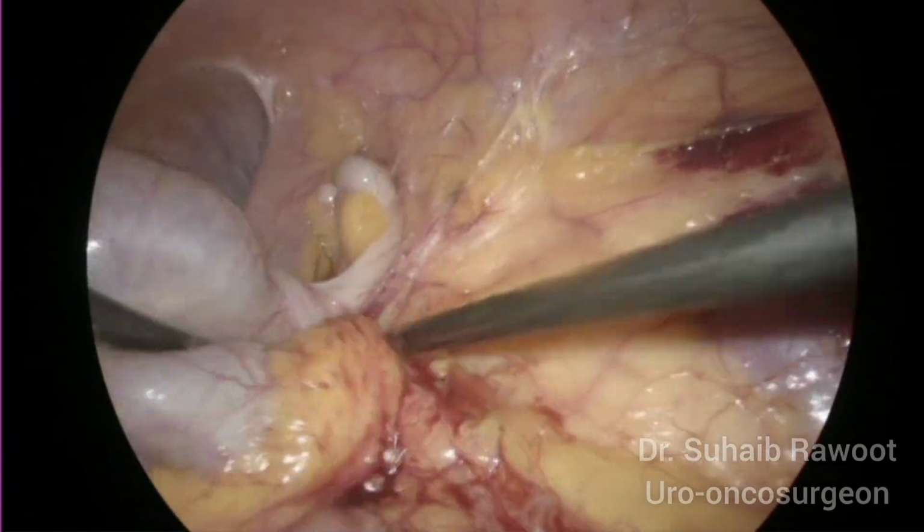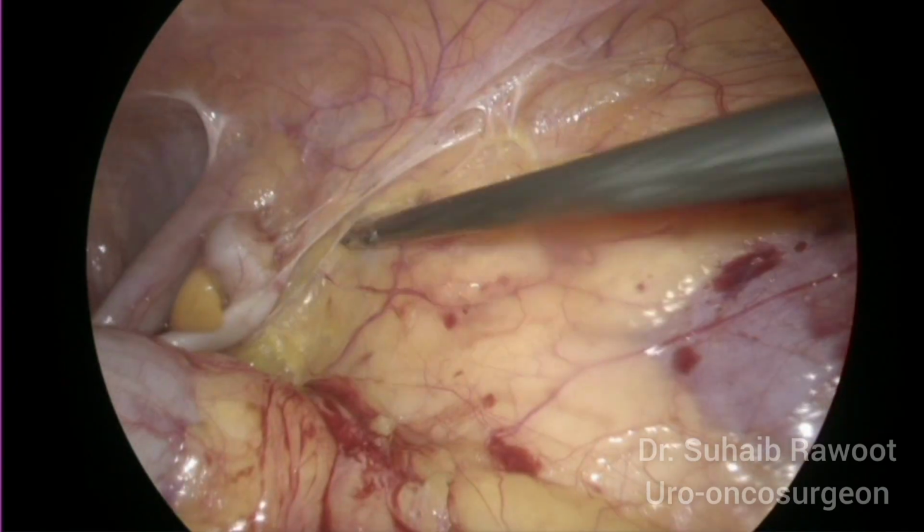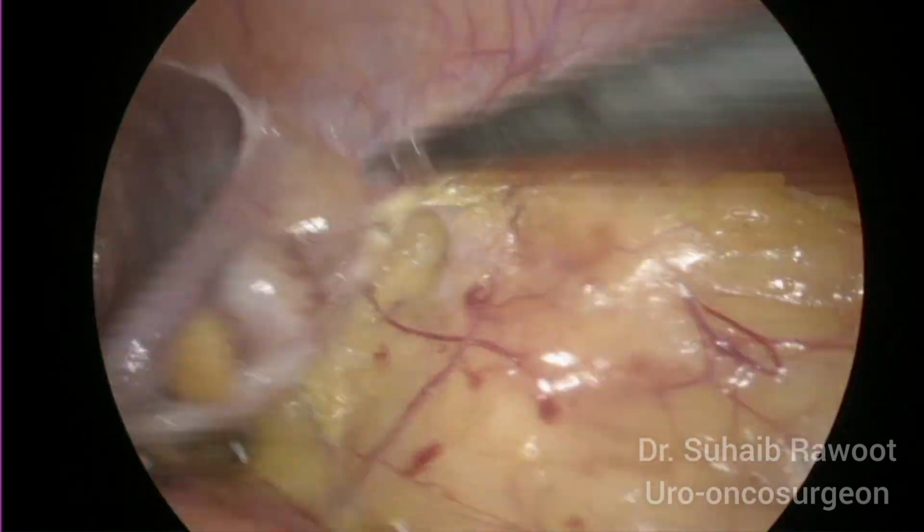So here you can see the difference between the two fats, and if you go exactly between the plane between the two fats, you will encounter less bleeding.